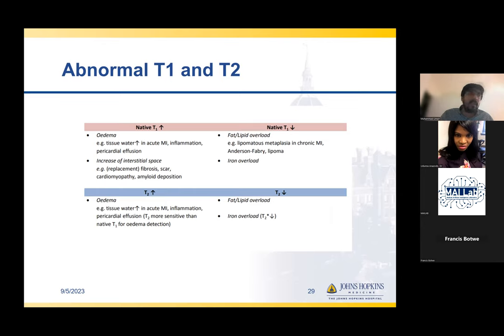Essentially, the way I think is that iron is going to disturb the magnetic field and all the signal intensities are lower, but conceptually that's not true. That's just a memory aid for myself. What iron overload does is, when your transverse magnetization is dispersing, it perturbs that and dephasing happens faster. That's your FID, the free induction decay. Since it happens faster, your T2 star values are shortened, and since your T2 values rely on your T2 star values, T2 values are shortened too.